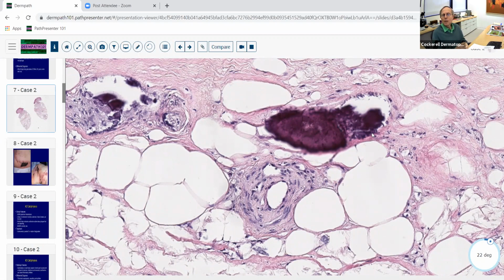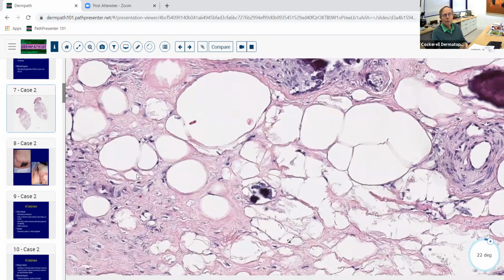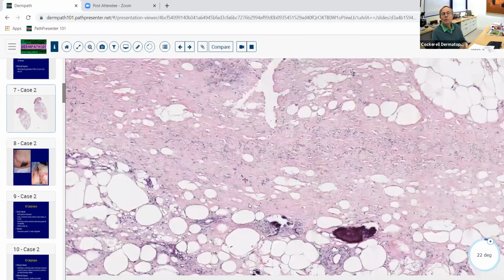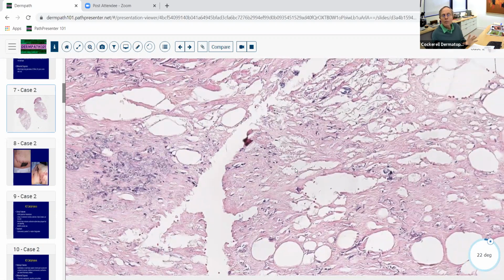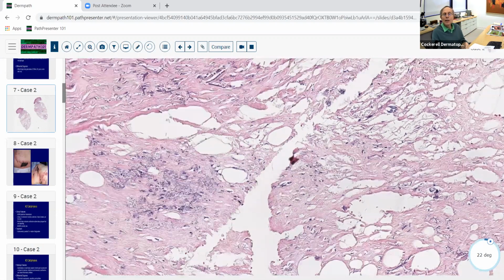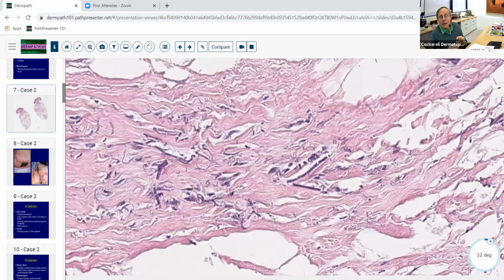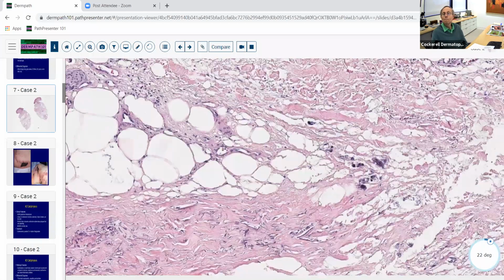So it's probably either a venule or maybe an arteriole that's calcified. You've got some other calcifications over here, a capillary that's calcified here most likely. And then you've got some calcification that's probably present just in the soft tissue up here, just in the dermis. So we've got the spicules of calcium. We've got calcification of blood vessels. We've got some calcification of these elastic fibers. And sometimes when you get calcification of the elastic fibers, they can take on a pseudoxanthoma elasticum-like morphology. We talked about PXE, I think last time or maybe a couple of weeks ago.